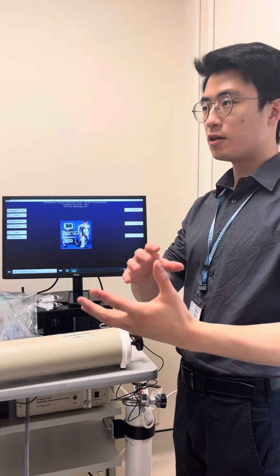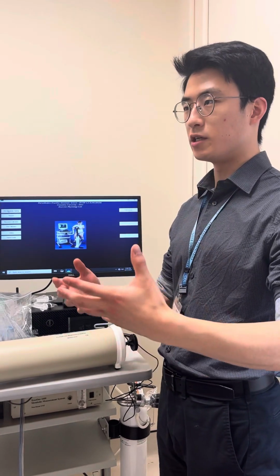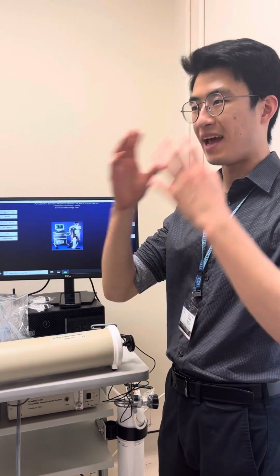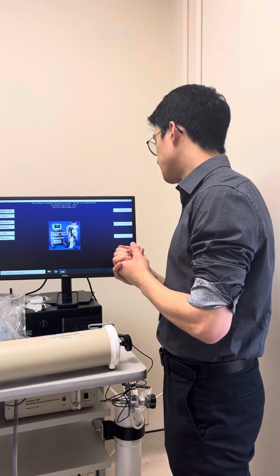And conversely, with carbon dioxide, when all of those things are happening, metabolic processes are generating carbon dioxide, and so we're measuring at the mouth. It's very important that we're measuring the carbon dioxide output.